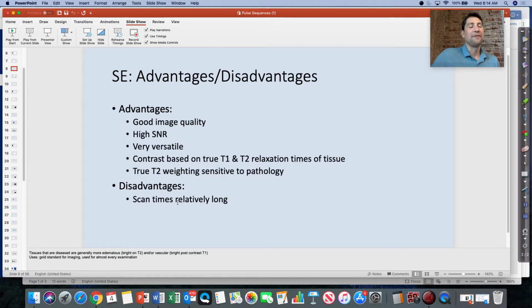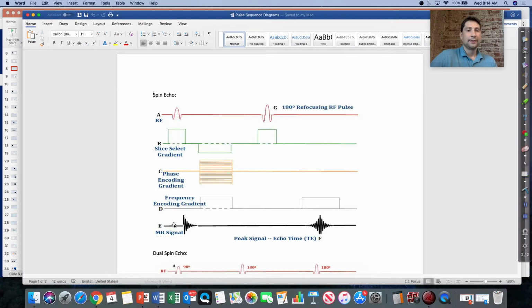Have you guys seen some of those MRCP sequences where it's just like hold your breath and it's boom, quick and easy, almost one shot, and then they do different angles of the biliary ducts? Okay, so you've seen that a little bit. Those are typically gradient echo pulse sequences because you're able to scan very rapidly. So the spin echo has relatively long scan times, and I'll show you why. We are almost governed by how the spins dephase and rephase.